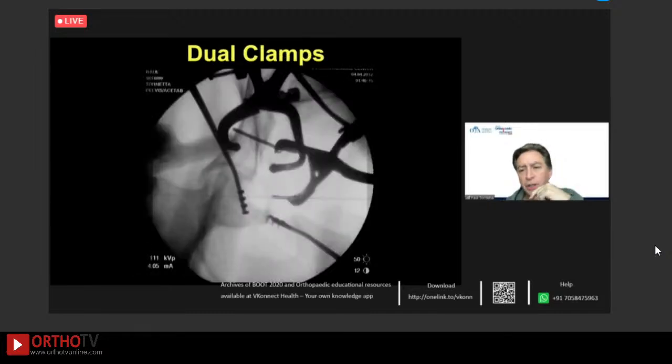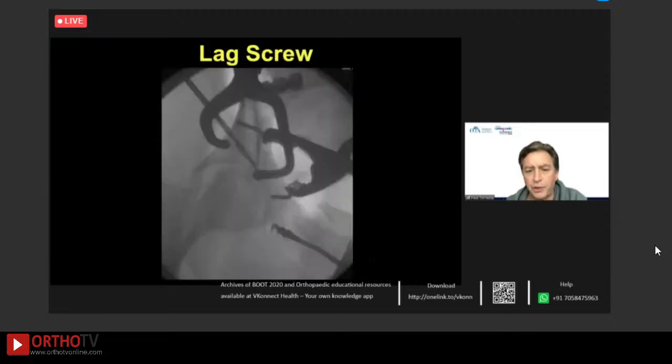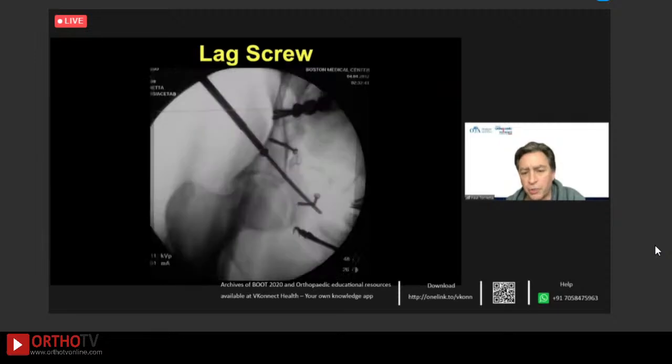So this is where I like the ilioinguinal, because it's very easy for me to place this clamp to compress the fracture this way while I'm compressing it over. And that always enables me to get a perfect reduction. Whereas when I do this through anything besides the ilioinguinal, I feel like I struggle a lot more. This is a pretty quick step. And then you can get an accurate reduction and you can place a percutaneous screw.